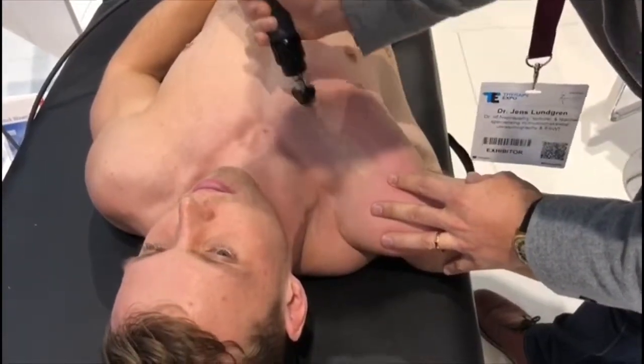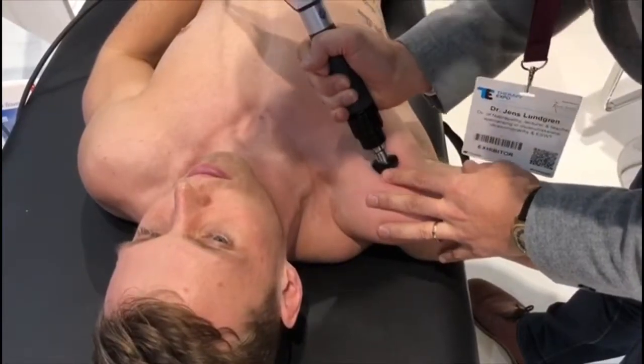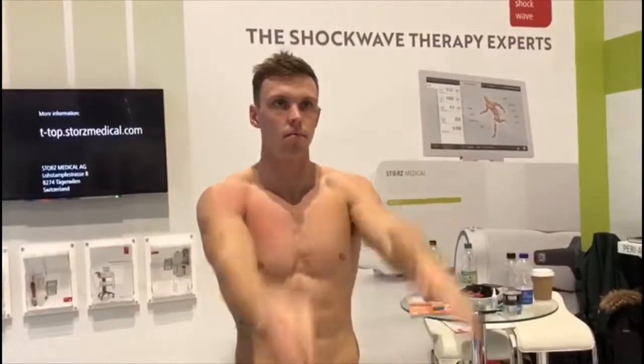Alright, so this region here seems to be a lot more flexible. Let's see how it works now. That's very nice.